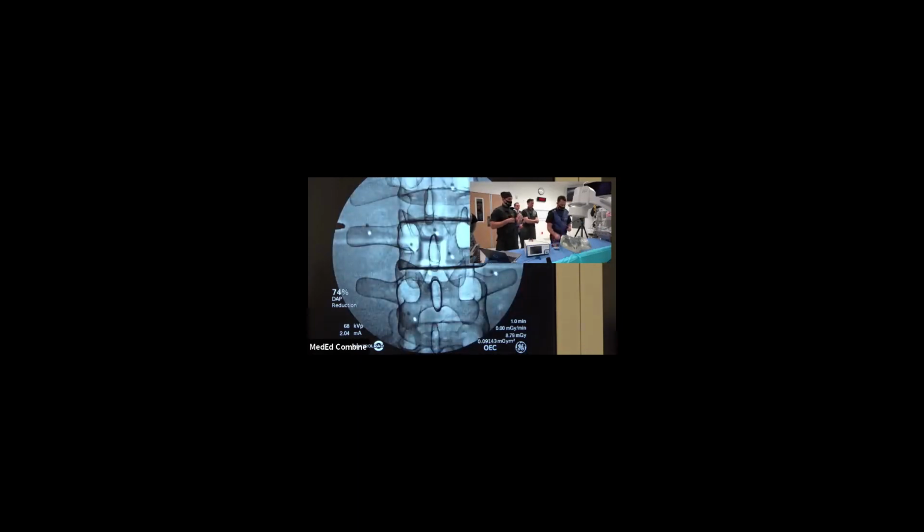So what Anthony's telling you guys, in case you're missing the point, is with kyphoplasty, you come in at a lot greater angle. It's critical with this that you drop your hands substantially and come in at a much less oblique angle. So I'm going to work my way down that pedicle. A lot of times I have my rep stand at the end of the table to take a look at what that angle is. I want my trocar to be at least 45 degrees from the spinous process, shooting up towards me, because that'll help me make the turn.